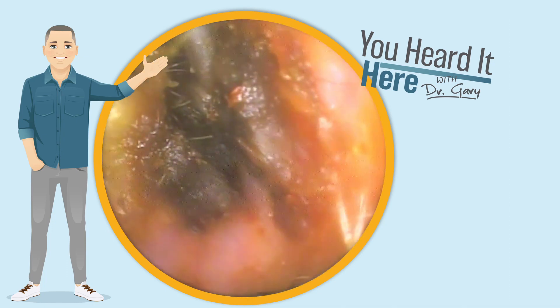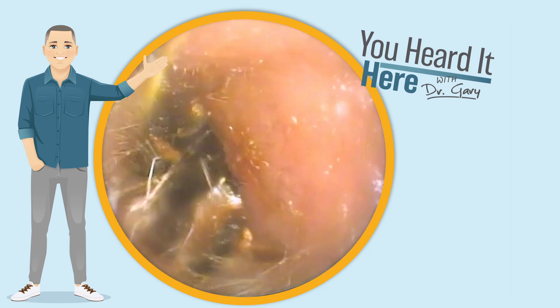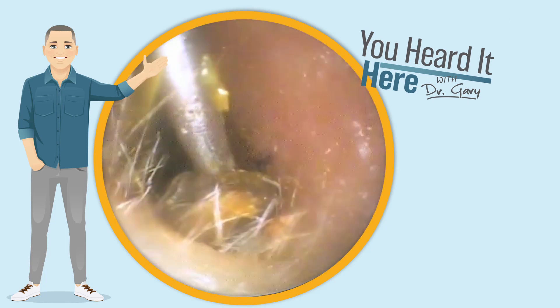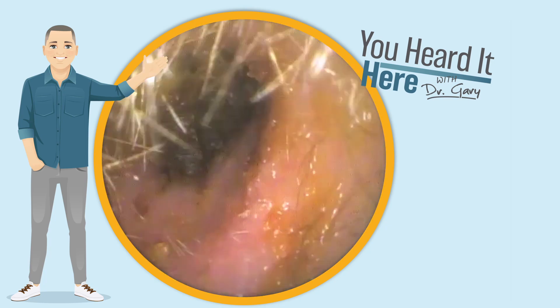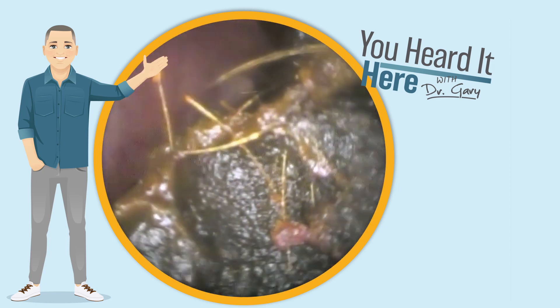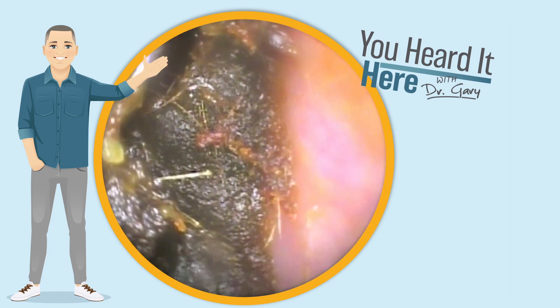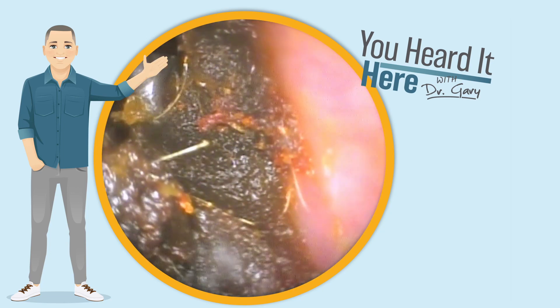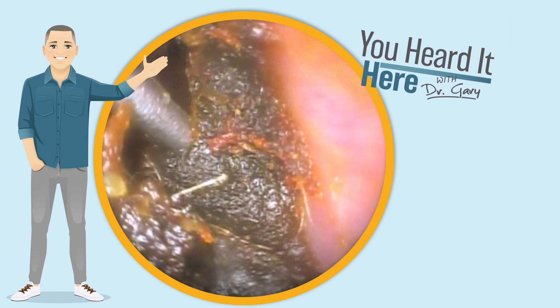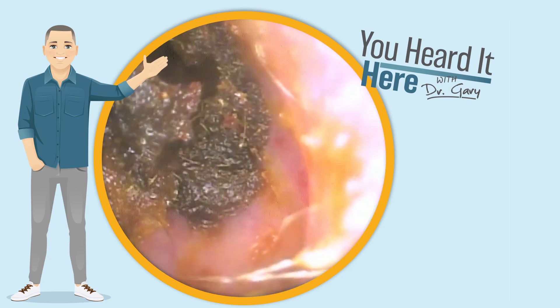One of the things that we've been asked to do multiple times is to attempt to show irrigation. So we're going to use a different camera angle later in this video to try to show the irrigation. Please take a moment to let me know what you think about the angle — we're still experimenting with it. Before then, we're going to use the curette to remove as much of this wax as we can, to at least get a partial view of the eardrum before starting the irrigation.